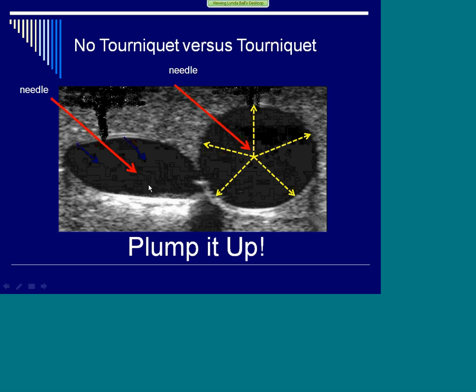And so we want to make sure, and it requires more push to get through here because this isn't a nice taut wall here. It's not tight. So then you have to really put the brakes on as soon as you break through here, and you feel that sensation of release of decreased pressure, decreased resistance. You have to make sure you stop really quickly. Otherwise, you're to the back wall before you know it.